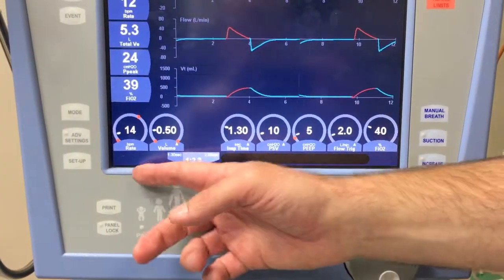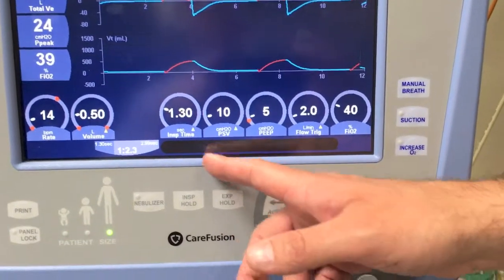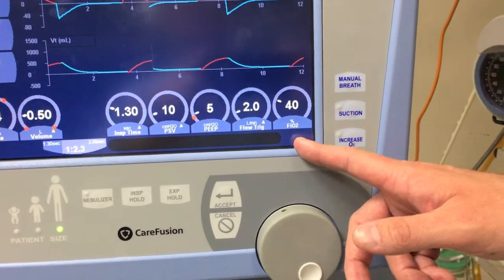In this mode, you can see we set a respiratory rate, a tidal volume, an inspiratory time, a pressure support, a PEEP, a flow trigger, and an FiO2.